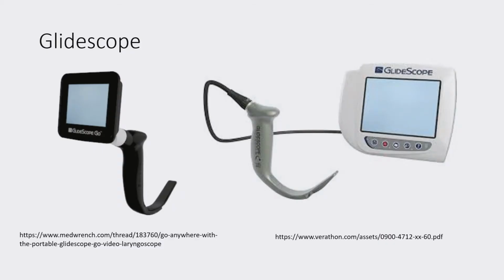The next equipment is the GlideScope. It also has a handle, blade, and electric cable that connects to a screen. On the left side is the same GlideScope with the screen directly connected to the handle.